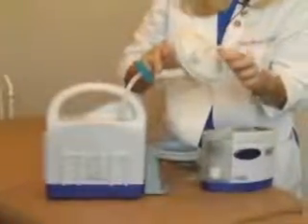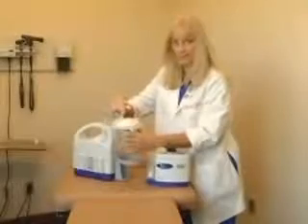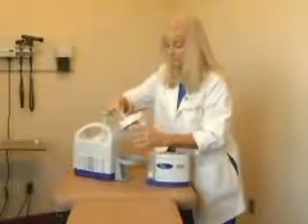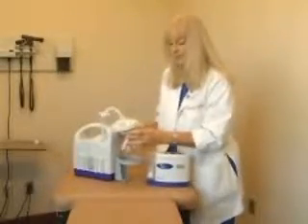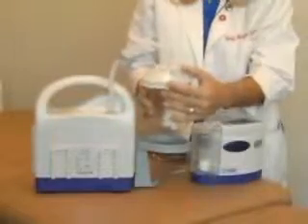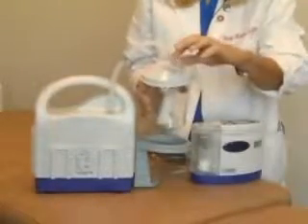On top of the canister lid, there are directional pictures that show you that this spout goes to the patient and this spout attaches to the filter. This is the pour spout, so you need to make sure that this lid is closed to secure your negative pressure system.